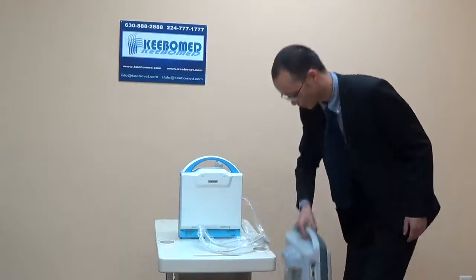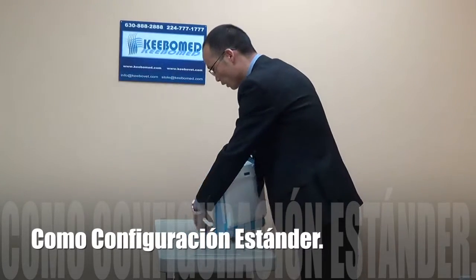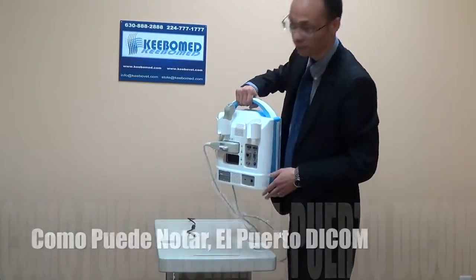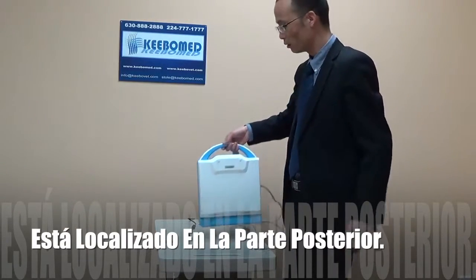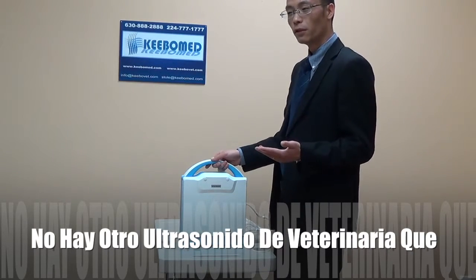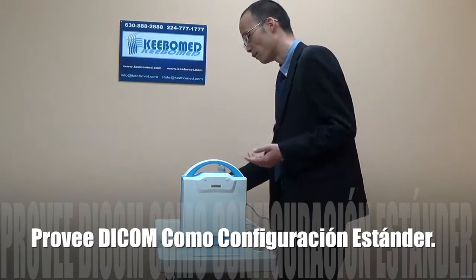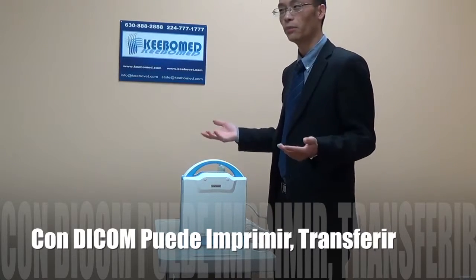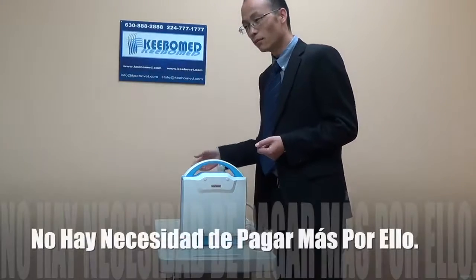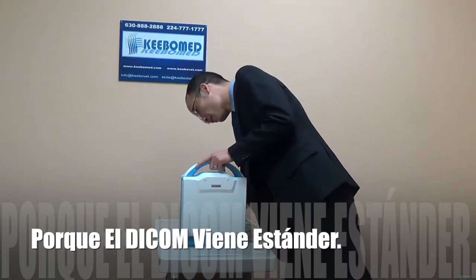This model comes with DICOM as standard configuration. As you see here, there is a DICOM section. As far as I know, there is no DICOM for veterinary ultrasound as standard configuration elsewhere. So this one helps — you can do many things with DICOM, like printing and transferring images to a computer. Most importantly, it is standard, so you do not need to pay extra for this model.